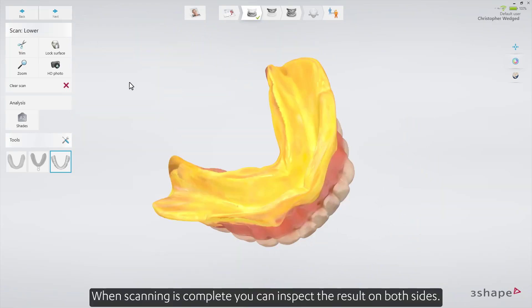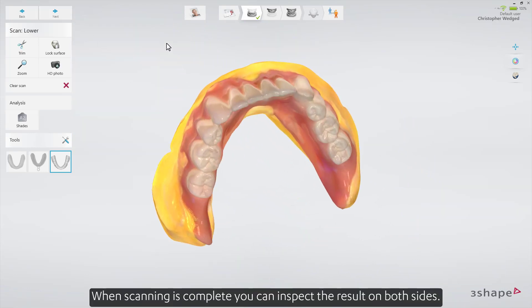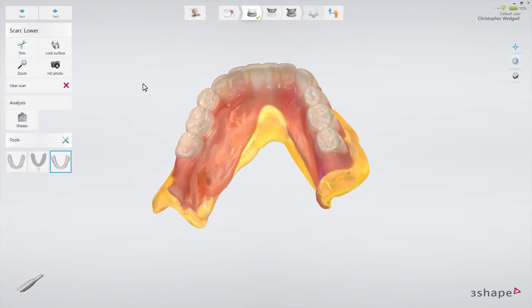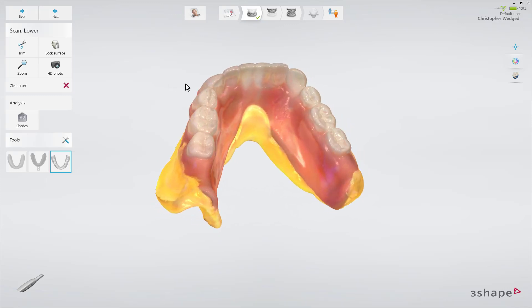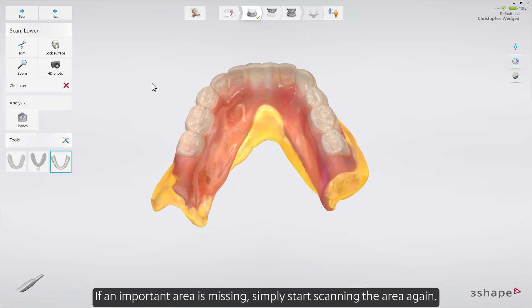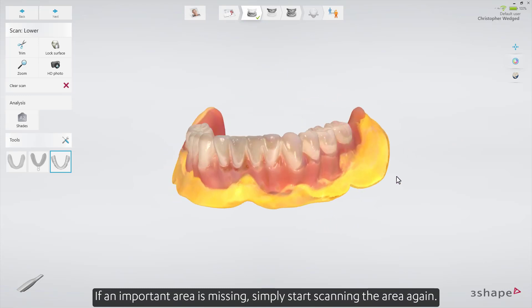When scanning is complete, you can inspect the result on both sides. If an important area is missing, simply start scanning the area again.